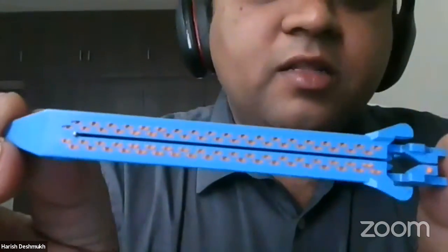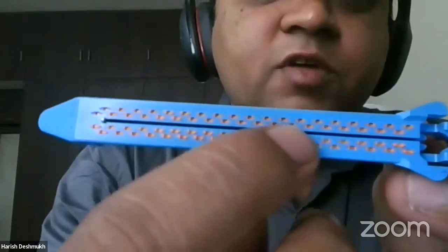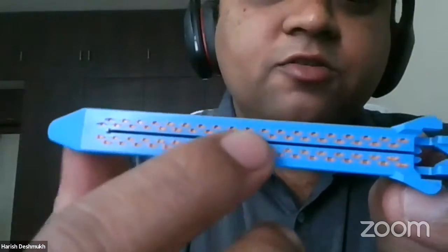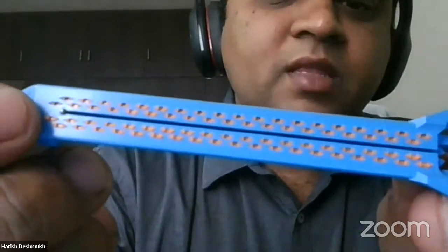One important factor to understand for everybody, sir, is that this is a 75 mm length stapler. The clean line you are seeing here is your cut line, so the knife will pass through this. If you observe it clearly, there is a staple which is beyond the cut line. This is one thing which should be kept in mind. So I'm just loading it again. That click sound should come, then only you see that it is fitting properly.